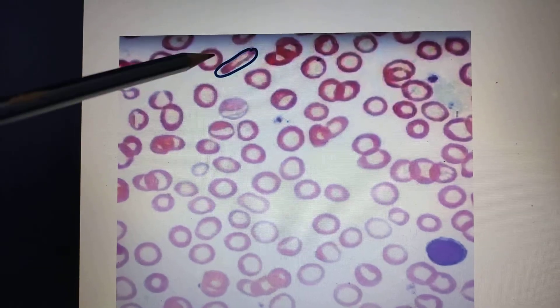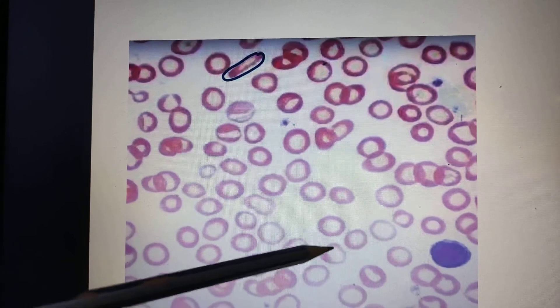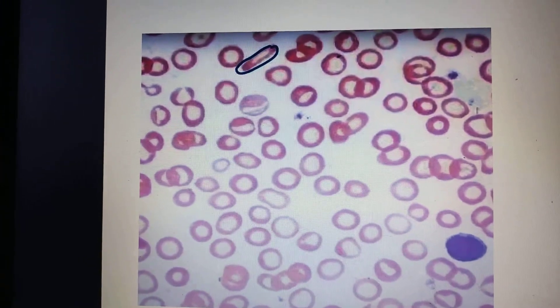So this is how you identify a peripheral blood smear of iron deficiency anemia. To recap: compare the RBC size with the lymphocyte, the central clearing is increased, and the shape and size of the RBCs are not uniform. This is the peripheral blood smear of iron deficiency anemia.